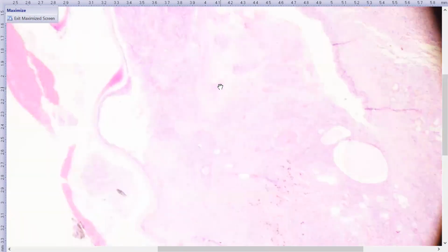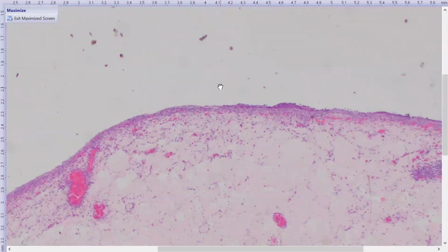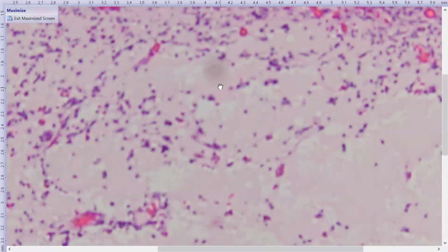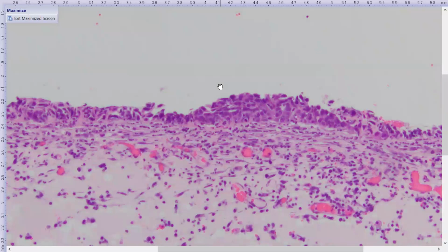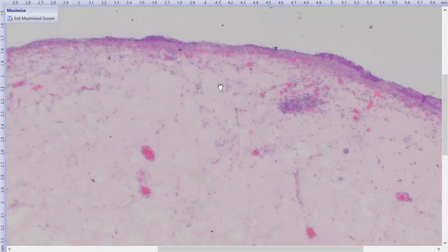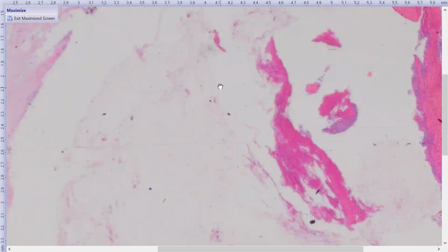And it's very interesting, I think, just to sort of track its progress and also how it tends to carpet structures. So for example, going back to that hugely edematous and prolapsed iris, you can even make out neoplastic cells on the surface of that sometimes. Don't get confused with the carpeting that Megan's discussing with metastatic pattern of carpeting. This is an epithelial, like an ocular surface pattern of carpeting. Yes, that is important to point out. This is basically a feature of epithelial neoplasia. It'll grow along surfaces as epithelium kind of seeks to do. So this doesn't tell us it's metastatic. It's most likely, as I said before, arising on the surface of the eye of this cat and then invaded inwards.